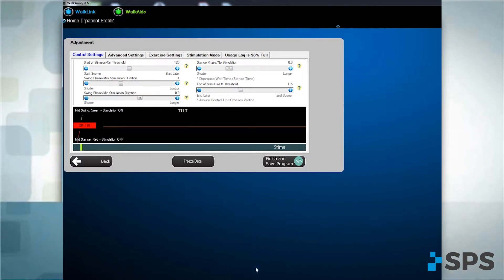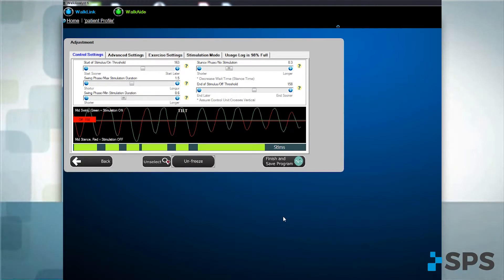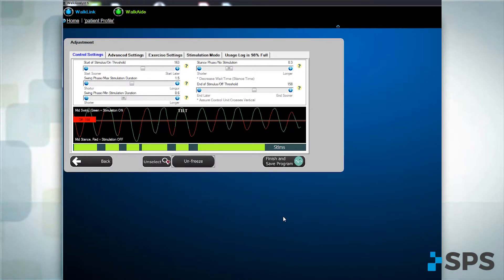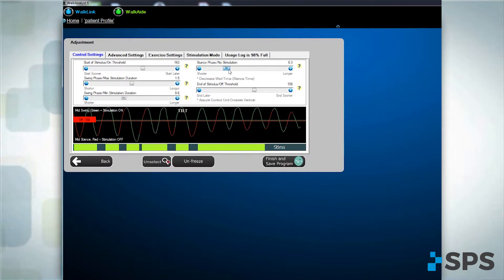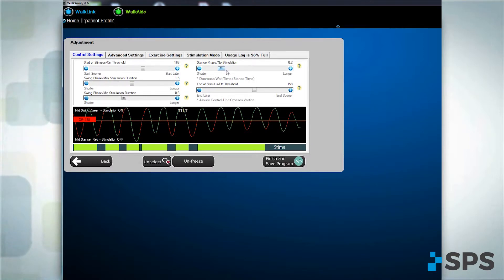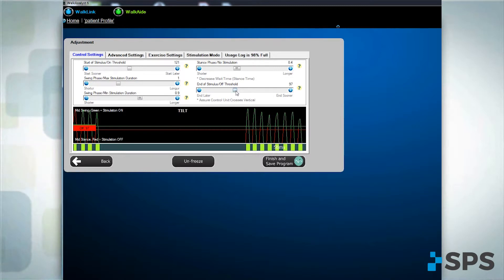Missing stims. To address missed stimulations, move the missing stim bar to the left. A shorter wait time allows the stimulation to occur with each step. You may also resolve missing stims by moving the end of stimulus bar to the right.